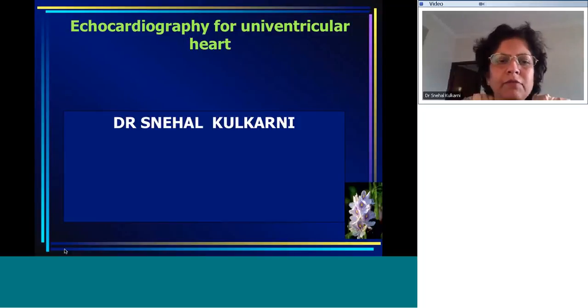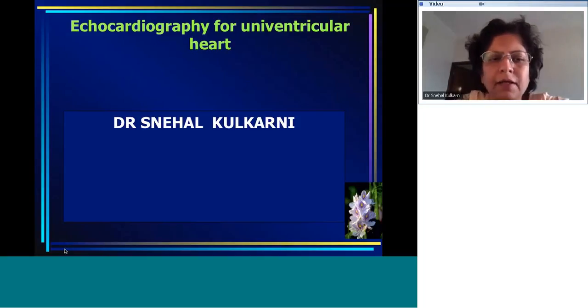We'll be discussing one important thing about the univentricular heart. As you know, the first step again starts with echocardiography before making any management decisions. Let's start with how we try to assess the univentricular heart and what the important aspects are when we decide the management options for univentricular heart.